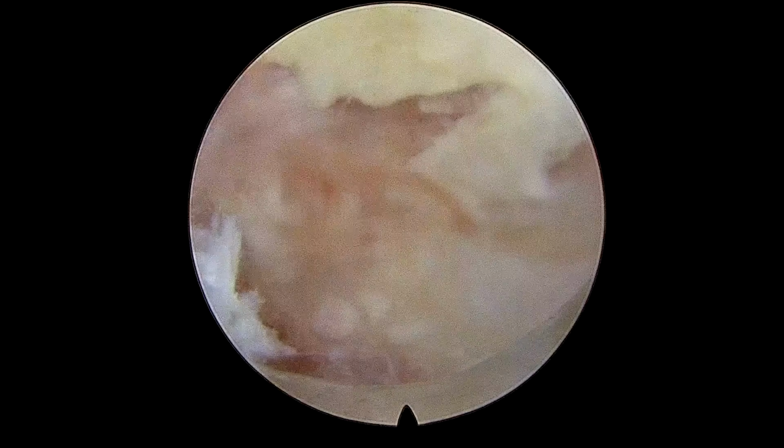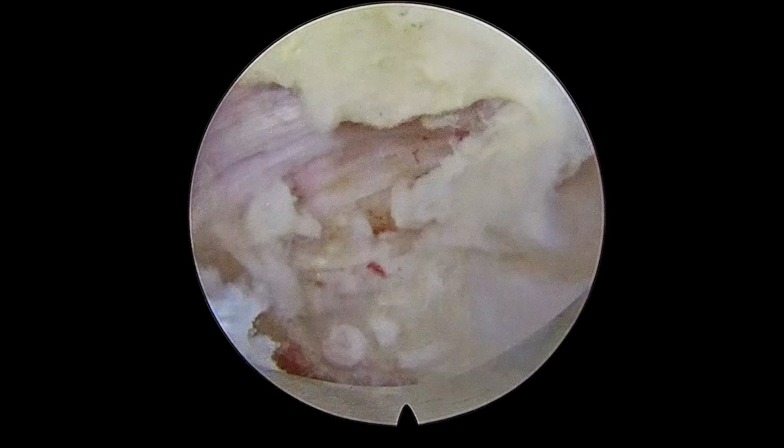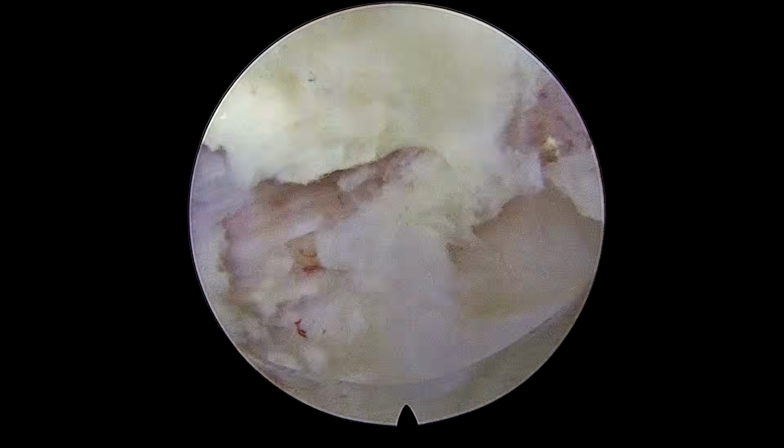Again the same thing applies here. Whenever you see any bleeding point, try to coagulate that point right away.